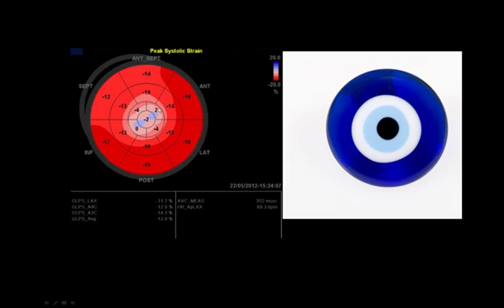And I'm calling this the evil eye pattern, just like in the Turkish literature. We actually have a series of these, about 40 of them, and we can show that the apical wipeout is very clear and distinct, and it leads to early recognition with longitudinal strain imaging.